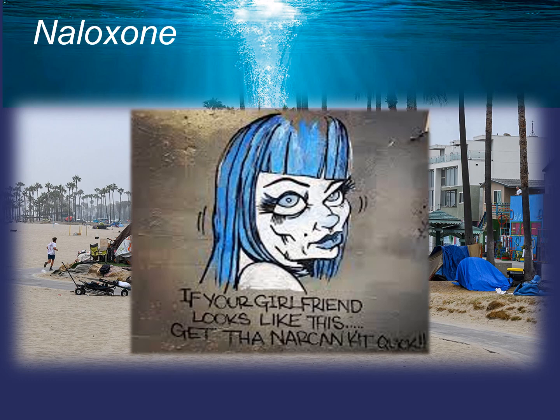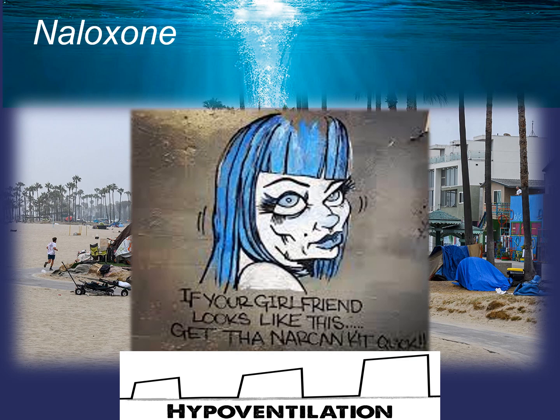For the patient with a pulse, can the patient be easily roused by verbal or tactile stimulation, or are they unresponsive to stimuli? What is the quality of their ventilations and perfusion? Do we need to intervene? Are the ventilations effective? Capnography can provide a window into the efficacy of the patient's respiratory status. An opiate overdose patient can present with an elevated EtCO2, increasing as the respiratory drive is depressed. It's not unusual to see extremely high numbers, such as 100, with an opiate toxic respiratory distress.